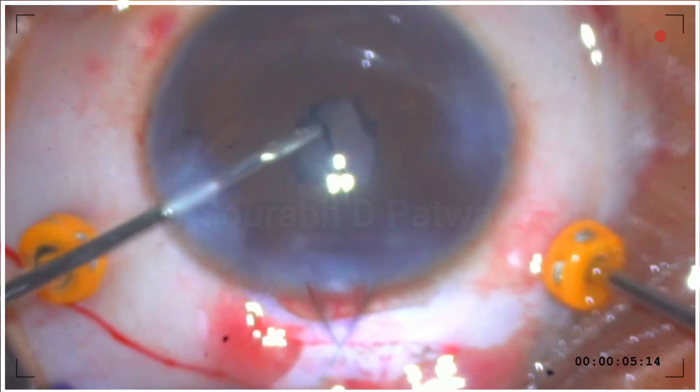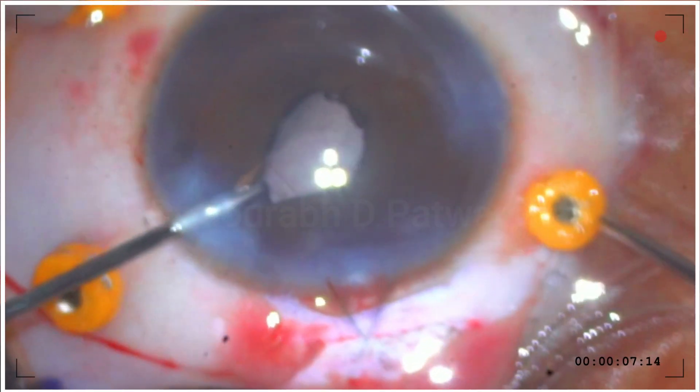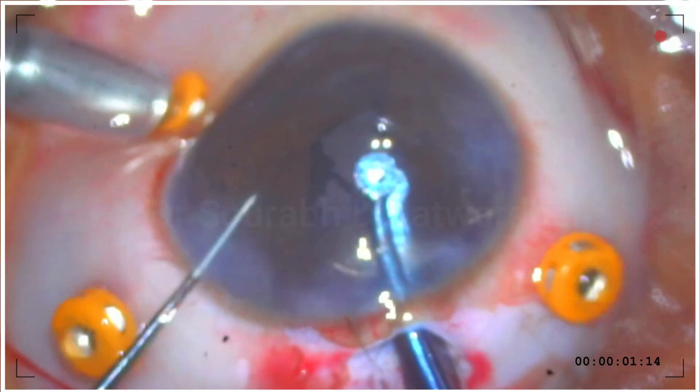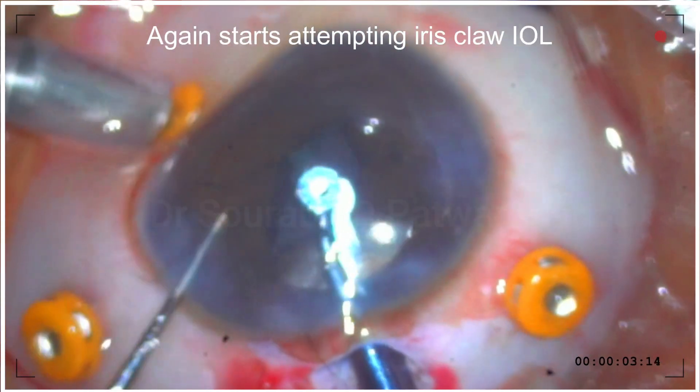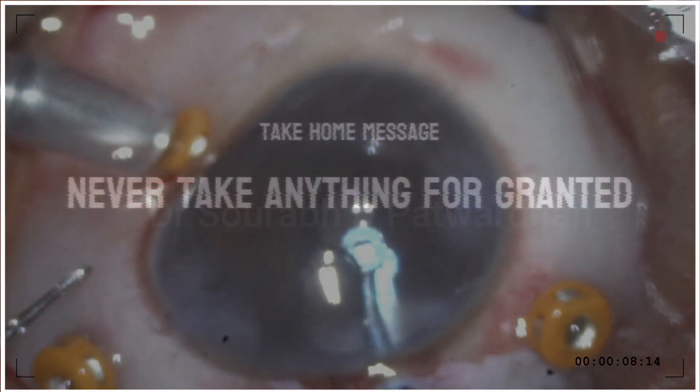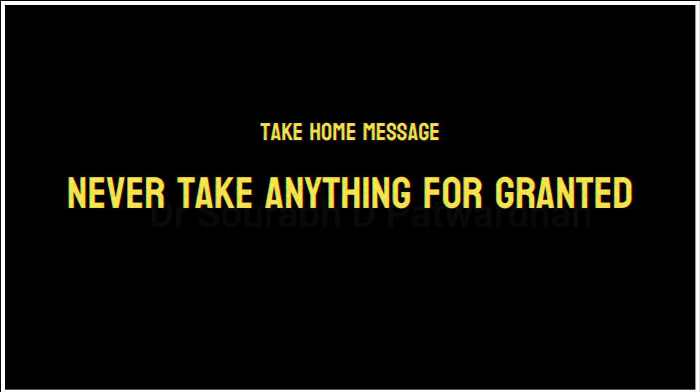He decided to take out this IOL. He put in the infusion from pars plana, three ports — a very skilled surgeon — and he was able to take out the iris claw IOL. But he again started attempting to enclave this iris claw IOL, and in doing so he damaged the iris as well.